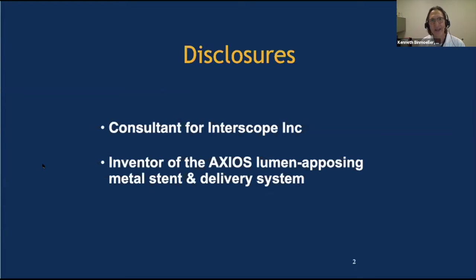Yes, a few exotic centers have been doing this for many years now. We've been draining the gallbladder, doing gastroenterostomies, draining the bile duct under EUS guidance. All of this is not totally novel, but with AXIOS, we have a tool that allows us, as a lumen-apposing stent, to really have apposition of the two cavities. And this is a very critical part of our treatment of WON.